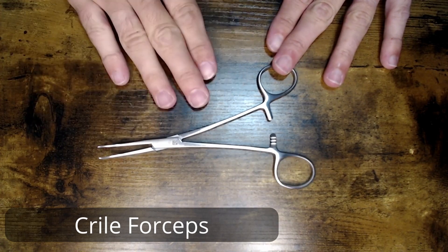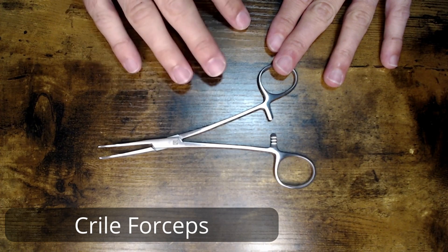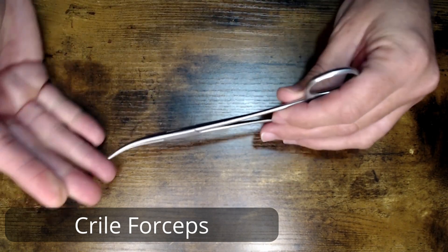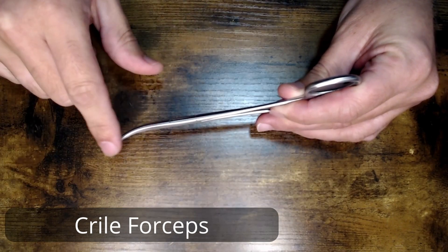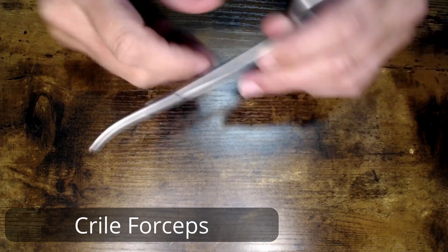It is a smaller clamp. This particular model that we're looking at today is six and a quarter inches long. It is the curved variation of the Kryal — you can kind of see that curve there at the end. They do come in a straight variation as well.